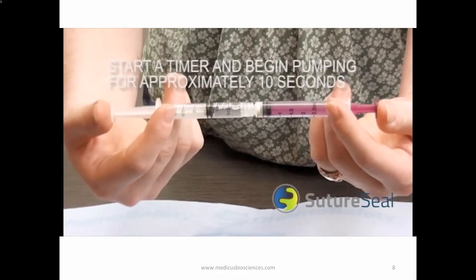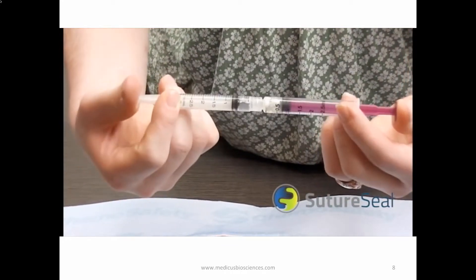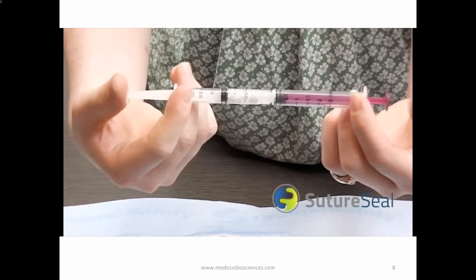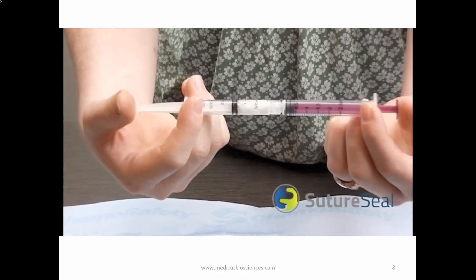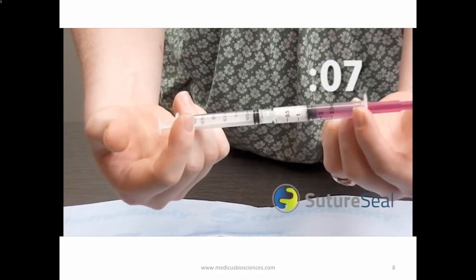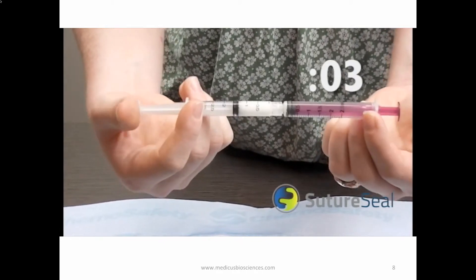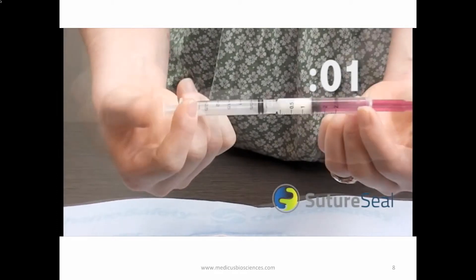Mix the contents of the two syringes by gently pushing the plungers back and forth for 10 seconds or about 15 strokes. Use a timer as it is easy to lose track of time, which will cause the product to become too viscous to apply. The formation of tiny bubbles in the mixture is normal.